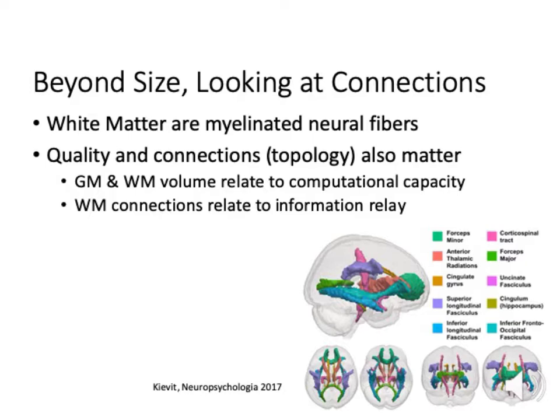The steps to perform this computation are very similar to voxel-based morphometry. First, the neural fiber tracts have to be reconstructed, and these tracts must be registered to a reference template brain, because this is the coordinate system on which individual tract-based comparisons will be done.